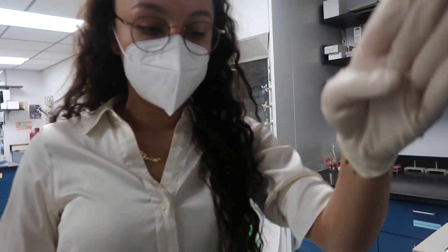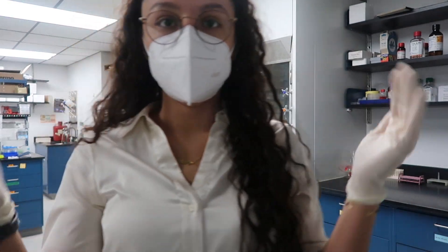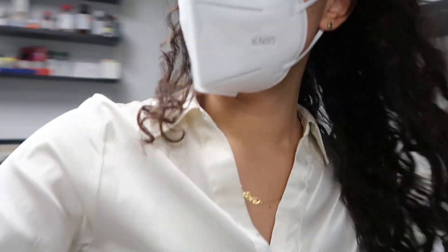Alright, so I'm washing with PBS with Tween. And by the way, Tween is like a detergent so that it perforates the tissue so the antibody can get in there. So now I'm washing — we're washing.